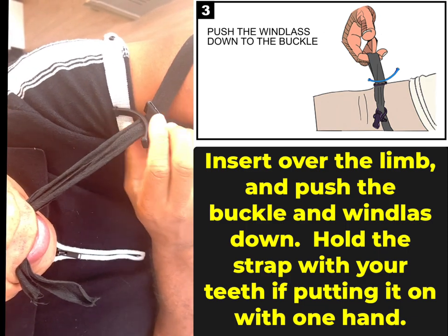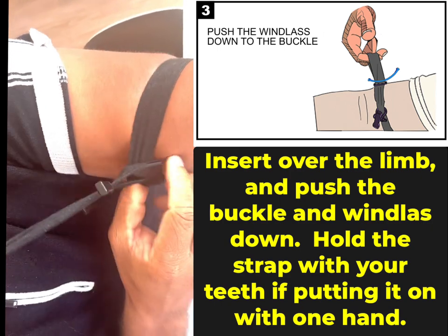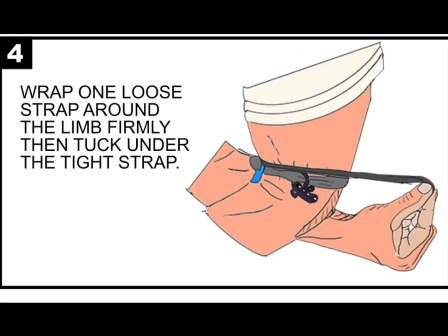Let's say I'm putting it on myself. If I put it on myself, I don't have an extra hand, so I'm going to end up using my teeth. I need to tighten it — this isn't tight enough. I can make it tighter. I'm ready to tighten the tourniquet, but first I need to wrap one side.